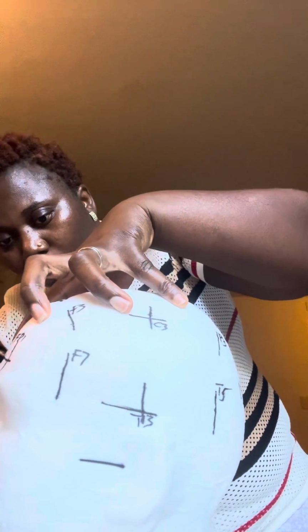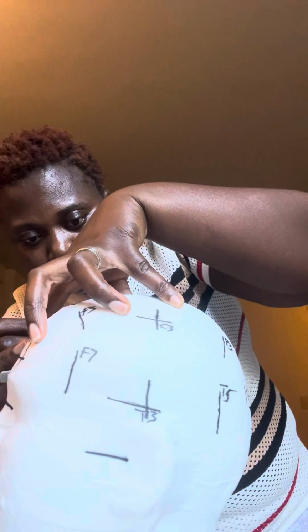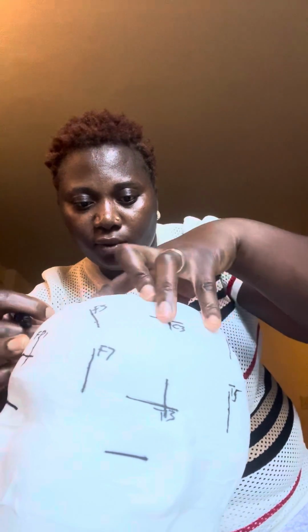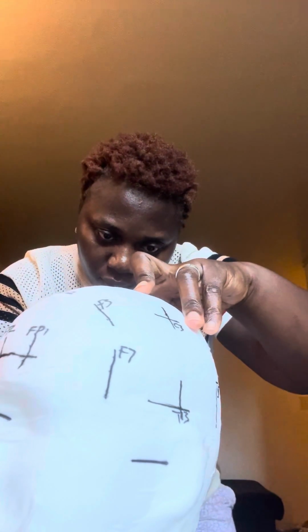You divide 23 by 4, F4 to C4, from C4 to get my P4.